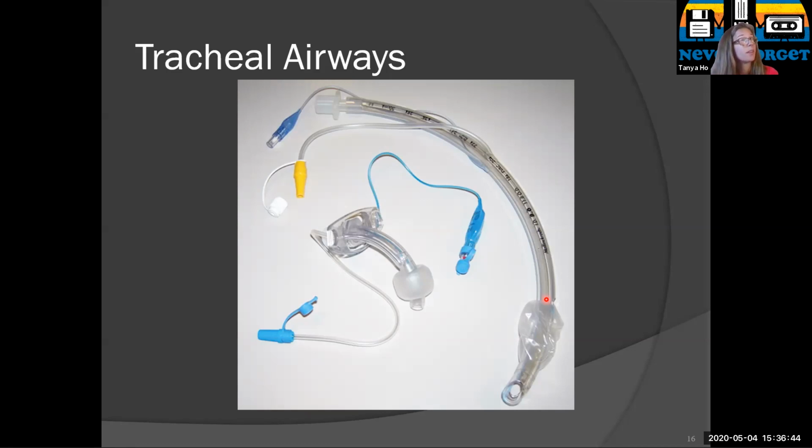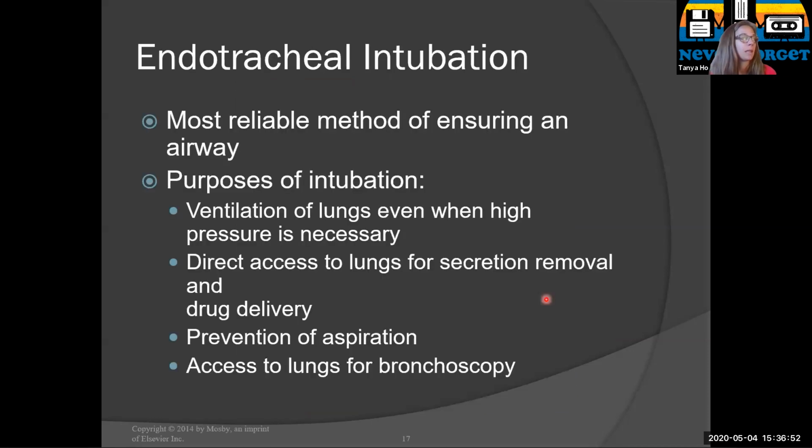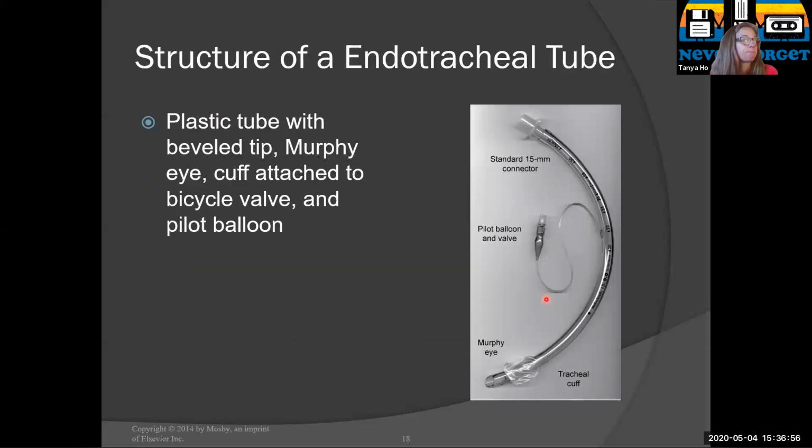Shucks, I just forgot the trade name that they use for it. If I remember it, it'll come to me in a second, so that if you hear somebody call it that, you'll be like, oh yeah, that's what that is. So yes, you need to know the parts of the endotracheal tube.